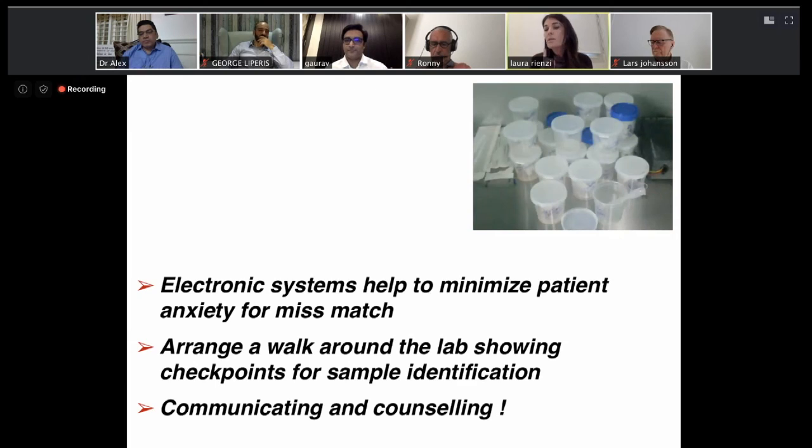But it's not only this, the advantage is not only the traceability for mix-up, because this is a rare condition, we are all trained for that, but it's also to have a control of timing of procedures, number of procedures performed by staff. I can know how many ICSI were performed by any member of the staff. If one is doing too much something and the other not enough, we can really have a control of the whole laboratory procedures. It's a very useful tool for quality control.